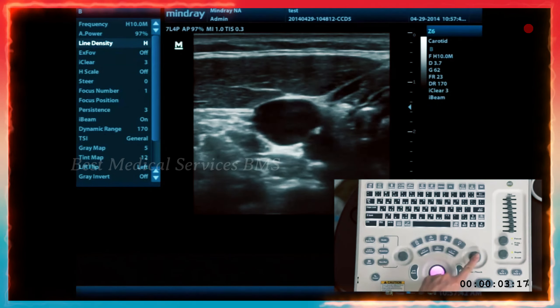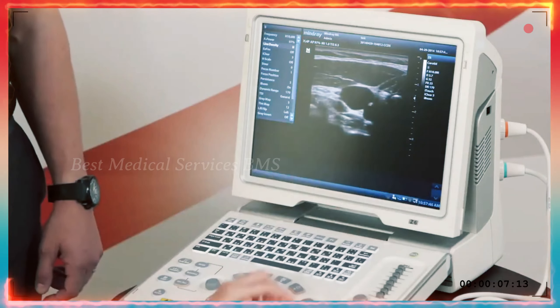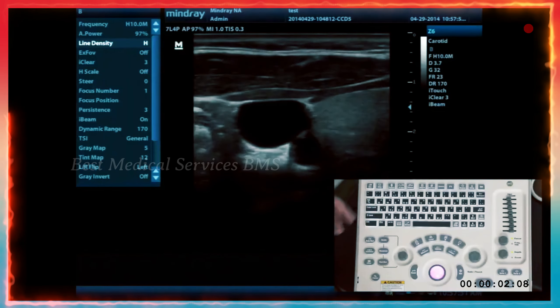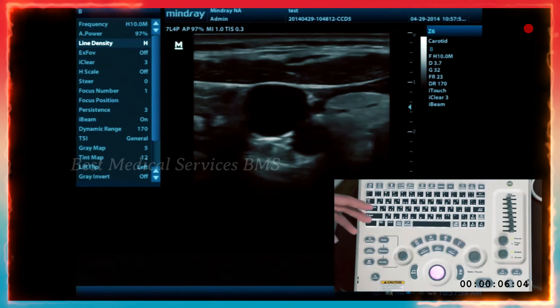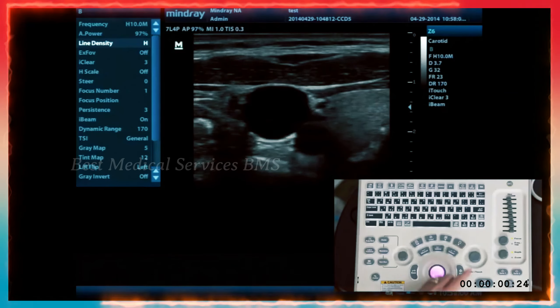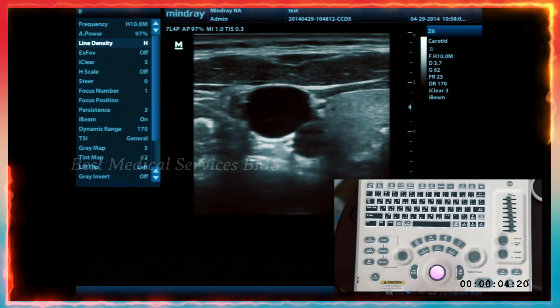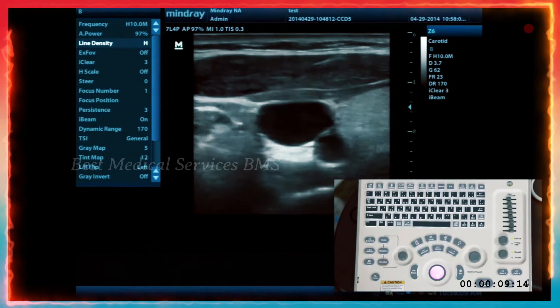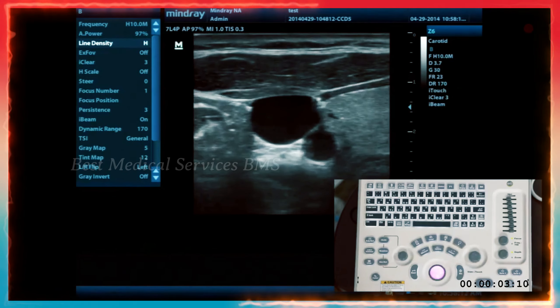When you press the gain/iTouch knob, iTouch appears in the top right corner list alongside frequency, depth, gain, and frame rate. iTouch is the auto-optimize feature for the machine. To disable it, press and hold the gain iTouch knob for about two to three seconds, and it will disable — you'll see it disappear from that column. You can use it on and off depending on each user, exam preset, and patient.